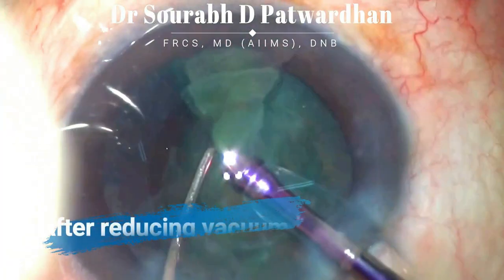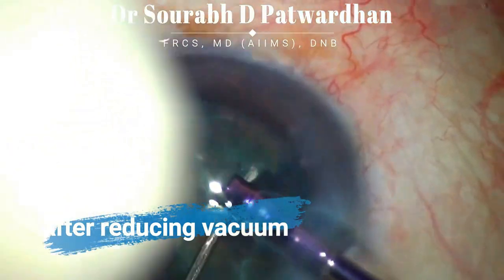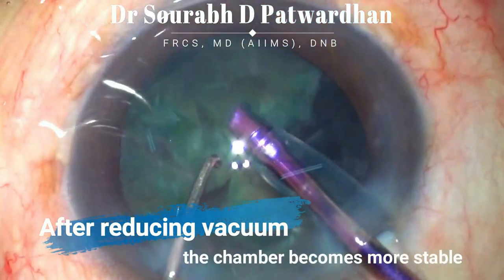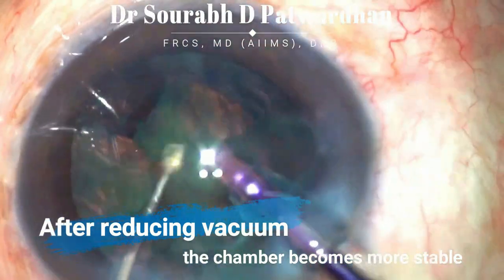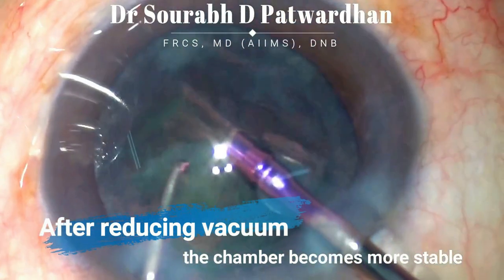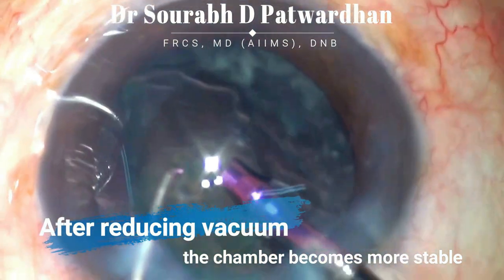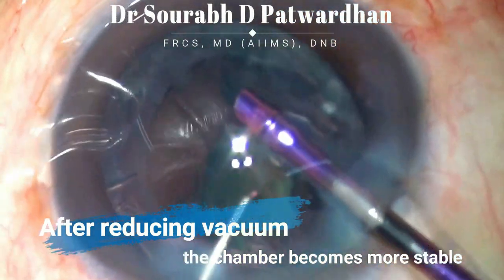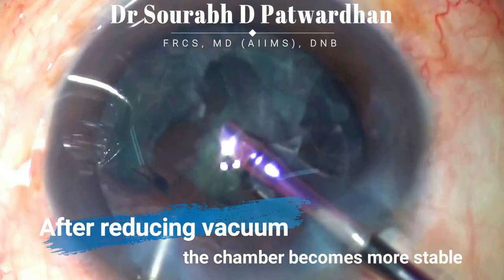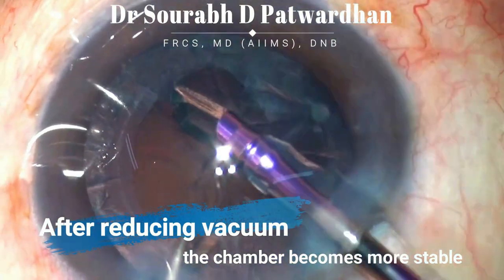Reduce the vacuum and increase the bottle height, and once you do that, you find that the surge is gone as the surgeon continues to emulsify the other pieces with the modified parameters. As the chamber becomes more stable, it is safer to emulsify the last piece. The preparation for the last piece begins quite early during FACO emulsification — keep watch on anterior chamber fluctuation and surge, and reduce the vacuum and increase the bottle height as per the need.